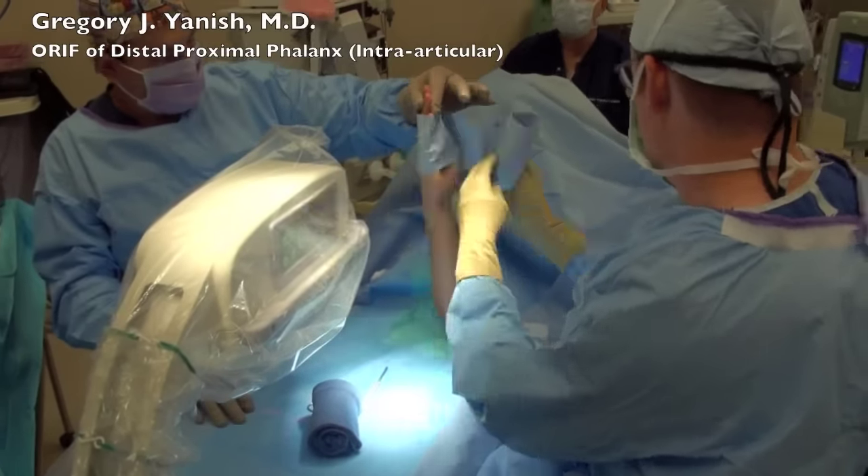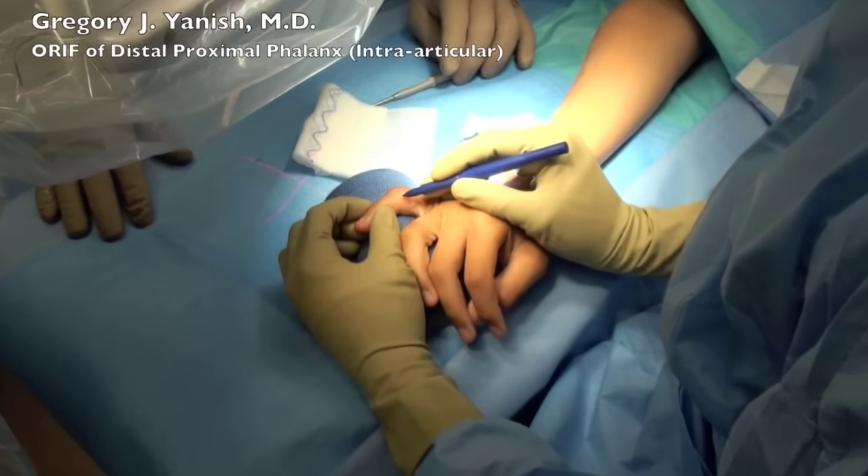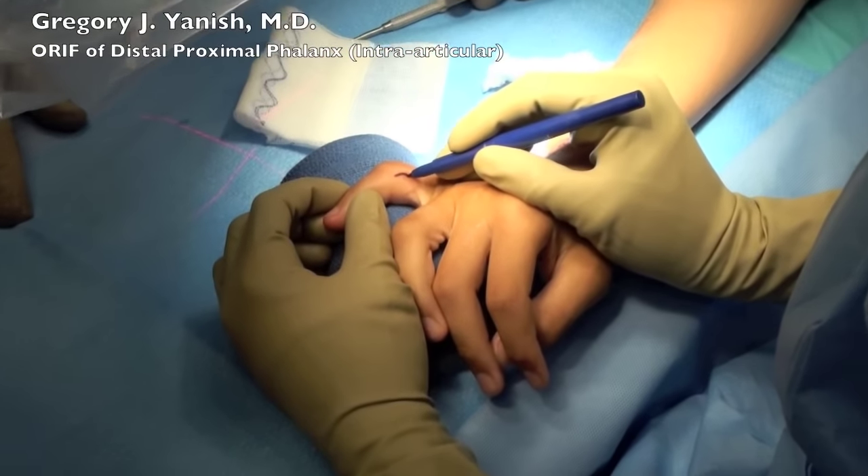We've placed an Esimark tourniquet to exsanguinate the arm, and an upper arm tourniquet is acting to prevent blood flow back into the arm during the surgery.